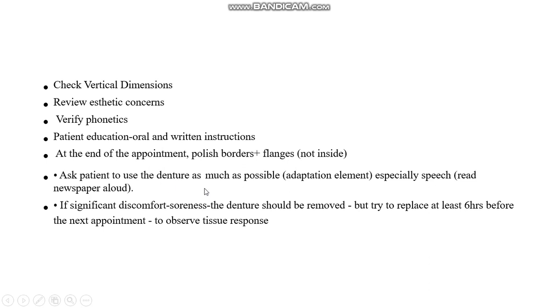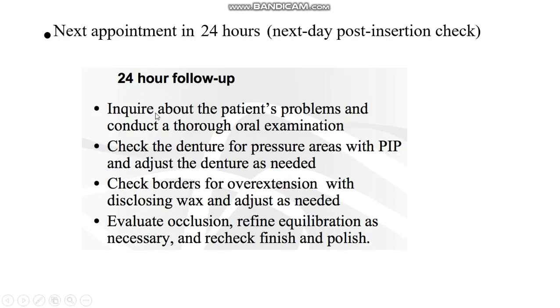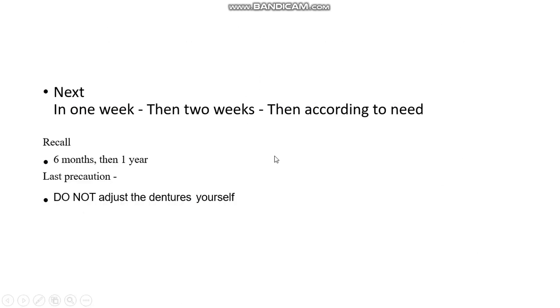Ask the patient to use the denture as much as possible, especially for speech. If significant discomfort, the denture should be removed, but try to replace it at least 6 hours before the next appointment, meaning the patient should put it back in the mouth 6 hours before coming to the doctor, to observe tissue response. The instructions for the patient are the same as those mentioned in the previous lessons.